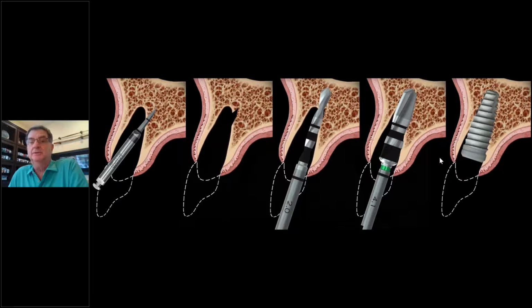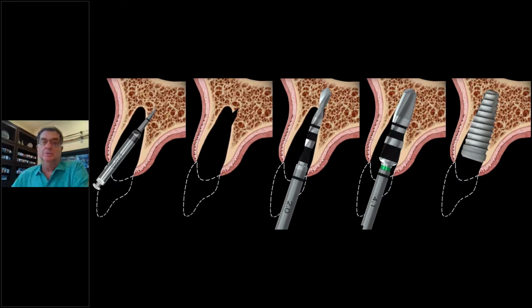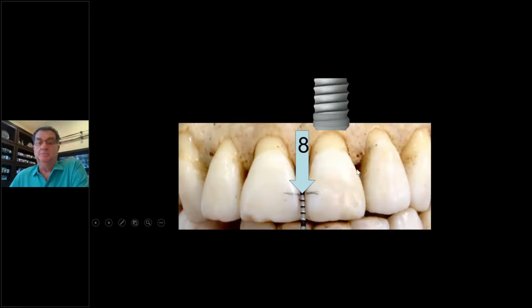Now, if you do that, how deep is it? Well, you put the implant in here, based on the skull study here, there's a normal scallop of bone in the front of the mouth. Now, the normal scallop of bone is somewhere between 2 to 4 millimeters between the interproximal bone and the midfacial bone. So when you place an implant correctly, based on the labial tissue and the labial buccal plate, about at the buccal plate crest, even though it's to the palate, you're basically 3 millimeters below the interproximal bone, and then there's another 4 or 5 millimeters of soft tissue below the papilla. So you're really 6 to 7, 8 millimeters below the papilla height. You have 4 or 5 millimeters of tissue and another 3 millimeters of bone.